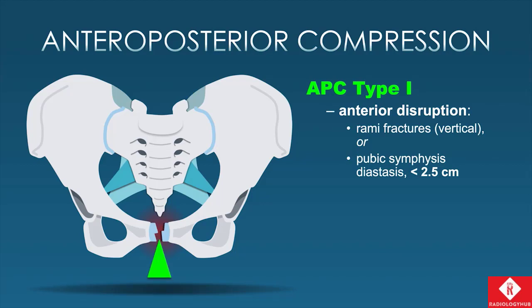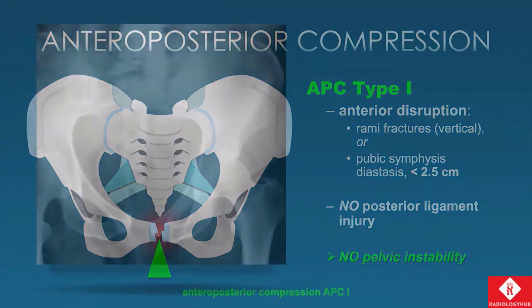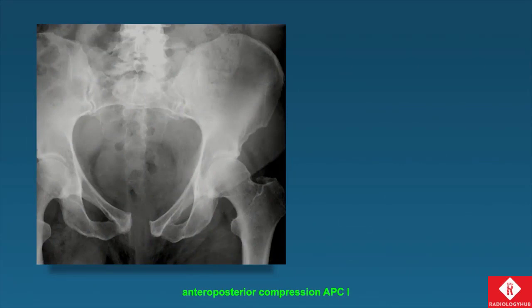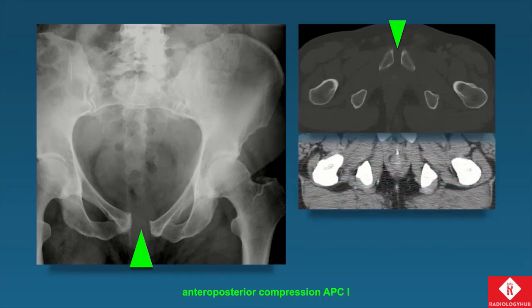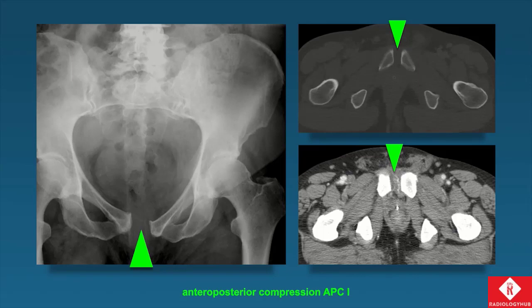With APC type 1, we can have symphysis disruption or, if it's a broader force slightly off midline, we'll see rami fractures — typically in a vertical orientation — instead of symphysial disruption. There is no posterior ligament injury, no pelvic instability. On radiograph we see widening of the pubic symphysis, and here it is on CT. Remember, when imaging these patients, they may already be placed in a pelvic binder or have a sheet around them, so some injuries can be reduced at the time of imaging. Notice this patient is bleeding anteriorly between the symphysis on the soft tissue window.